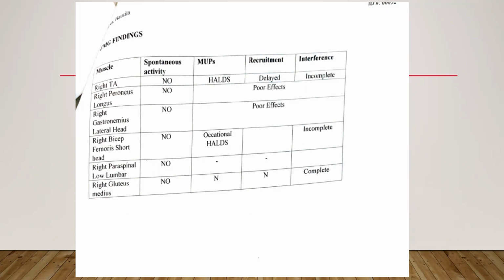We did not needle tibialis posterior. But gastrocnemius is affected, as mentioned. Gastrocnemius needling was abnormal. So that indicates this is suggestive of sciatic more than common peroneal nerve. This is more likely to be a sciatic neuropathy.